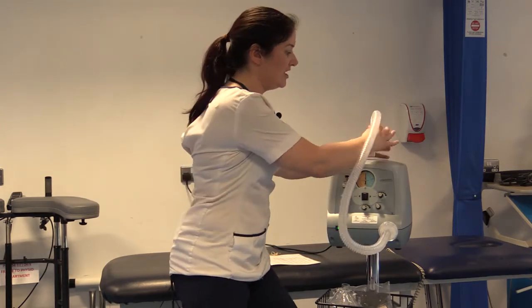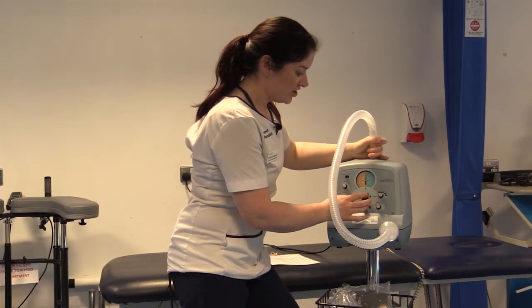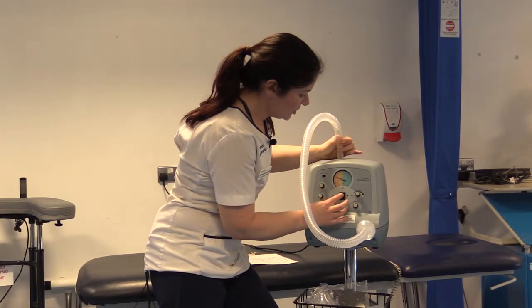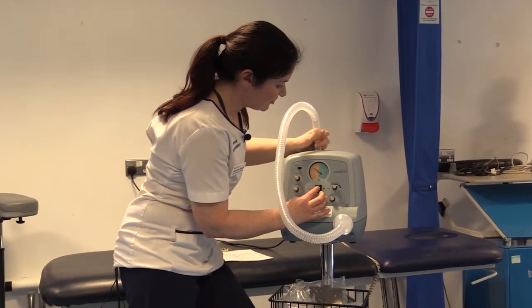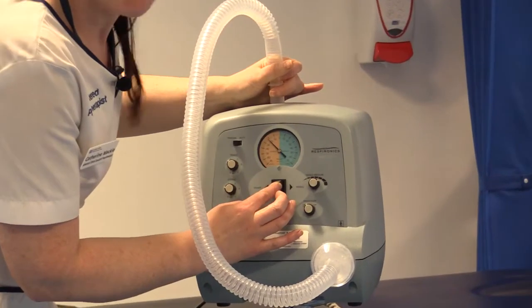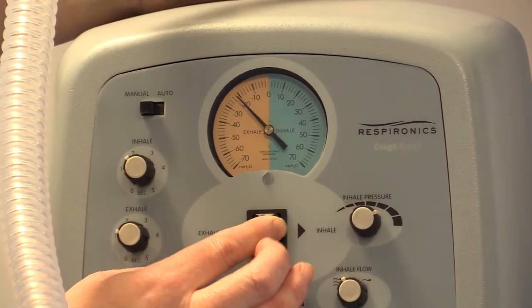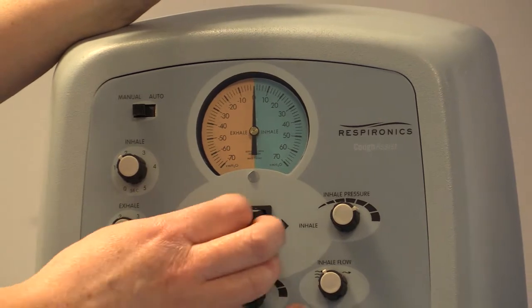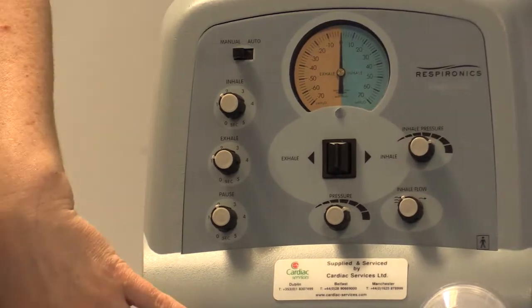To set the pressure, put it onto a hard surface. Because it's on wheels, you may need to stabilize it with your foot. Flick the lever here onto exhalation, then use the button at the bottom to select the exhalation pressure you want. It does take a minute or two to adjust, so give it a bit of time. As you can see, it's currently around 25 exhalation. This lever switches between exhalation and inhalation.